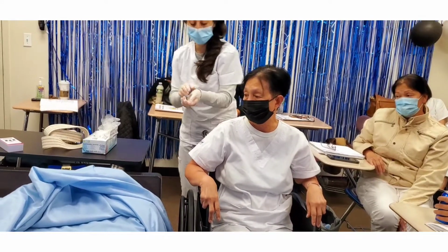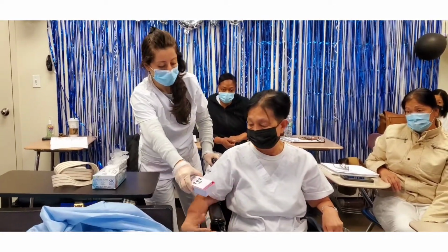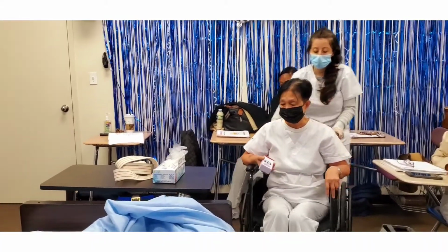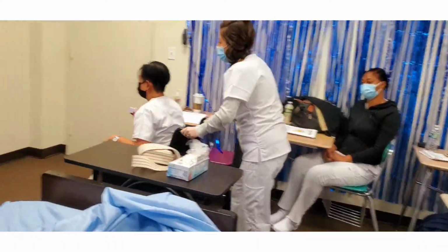I'm not harming you. Okay. I'm going to put down the gait belt and ask you to hold on to the rails. Are you okay, Ms. Carpio? Give her her call bell, take her out to her living room, and give her her call bell and her personal belongings. I'm going to take you. You have your bag, right? Your little mirror. Okay, perfect. And now we're going for a little walk.